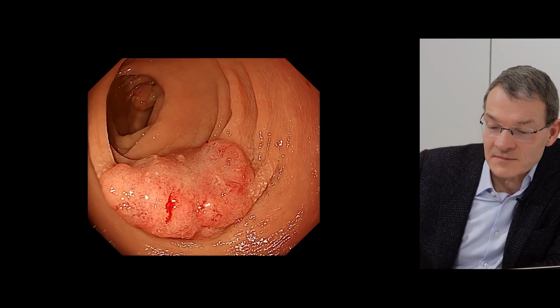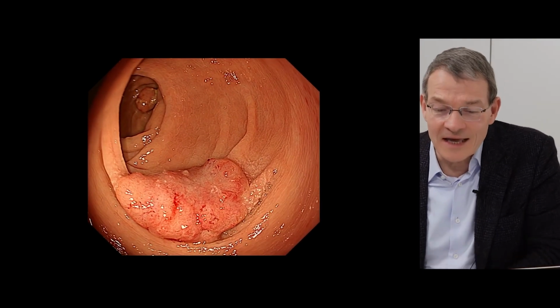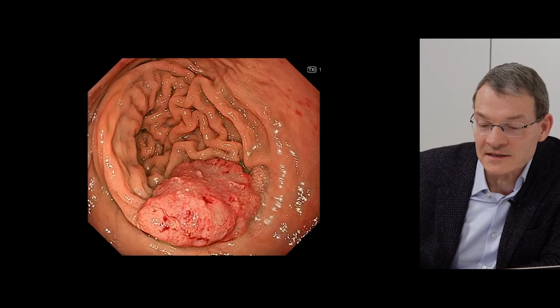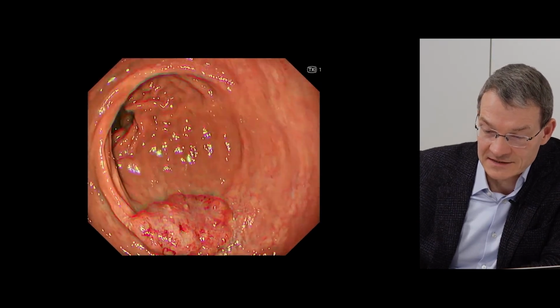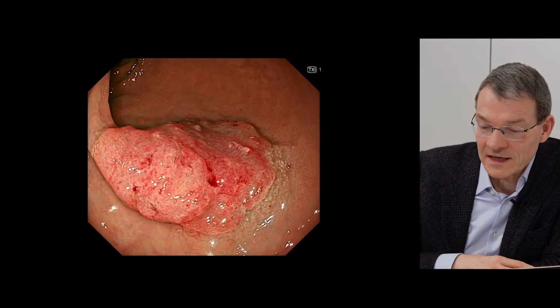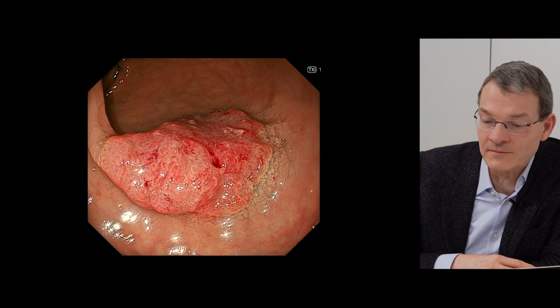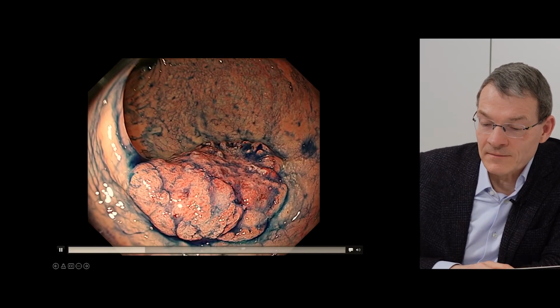Yes. Okay, so this is a second case now, and this is a more ugly lesion in the rectum. Yes. So, as you can see here, this polyp looks very suspicious for cancer, and already in the biopsy, intramucosal cancer was detected. So, yes, in such a situation, we first use TXI. We can better appreciate the more suspicious area of this polyp. Then we use indigo carmine.